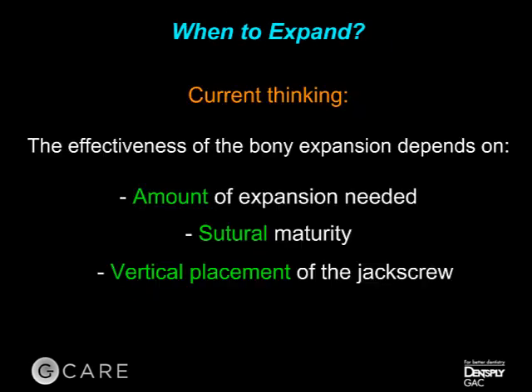So that is the third part of the current thinking, that vertical placement of the screw as high as possible in the palate can certainly improve the expansion effectiveness. The last part is the expansion appliance selection.